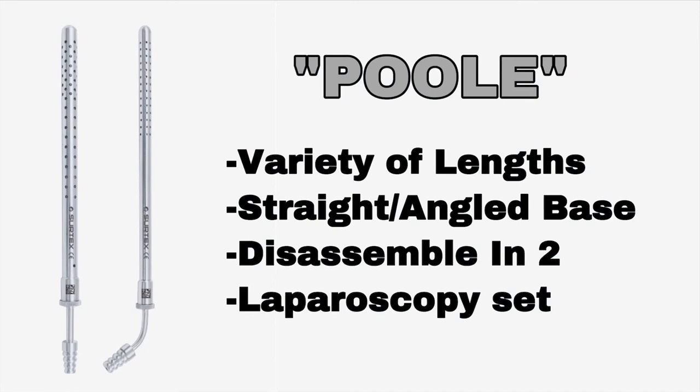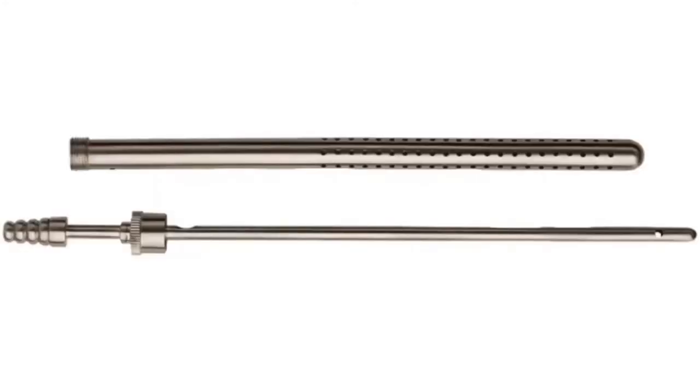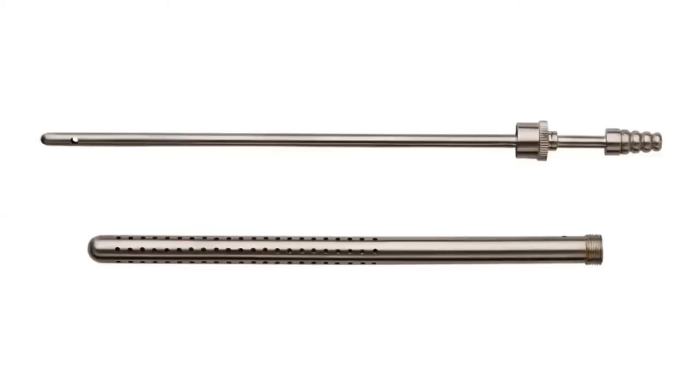This is the Pool suction. It comes in a variety of lengths and can be straight or angled. It has to be disassembled prior to cleaning and sterilization, and it is commonly seen inside laparoscopy sets.